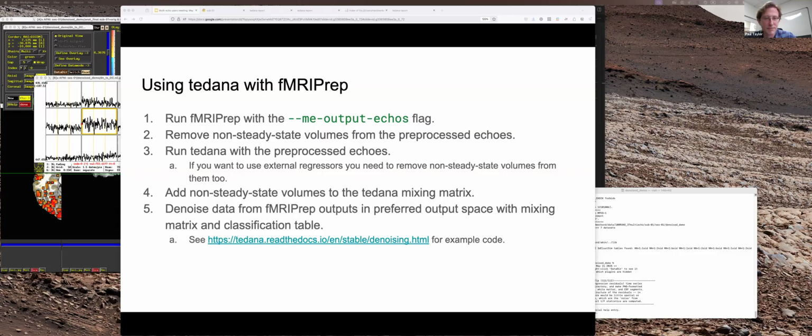And I'll add, with all the quality check measures in AFNI, when you do blow things up by messing things up, it lets you know. So it's much harder, if you bother to look at the QC stuff. It is much harder to make a big mistake and not notice it. I mean, it's hard. I shouldn't say much harder. It's hard to make big mistakes and not notice something's wrong.